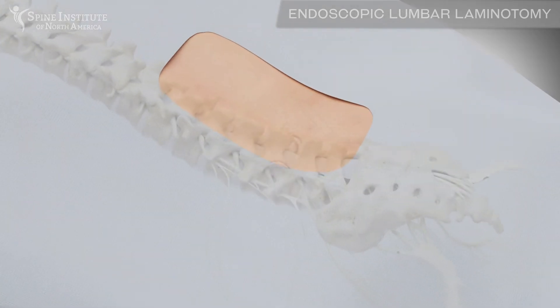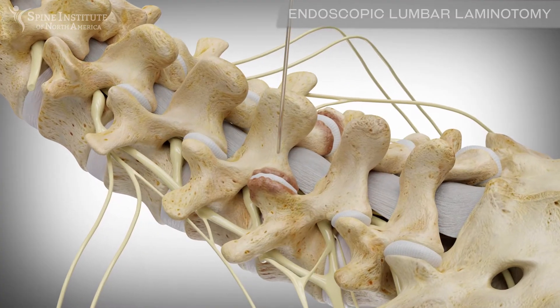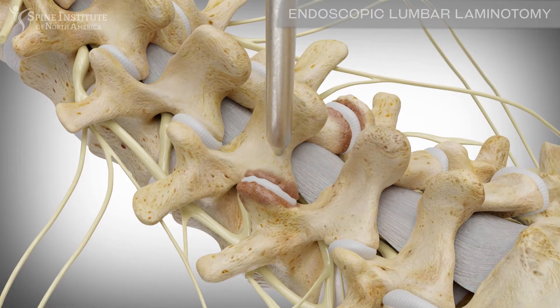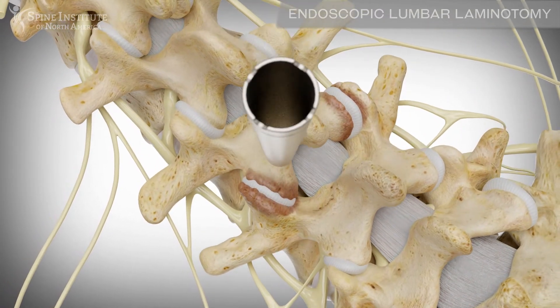The surgical site is located by placing a small guide wire to the appropriate spinal level. A dilator, smaller than a pencil, is then placed over the guide wire. A tube is then placed over the dilator to create a portal down to the vertebrae.